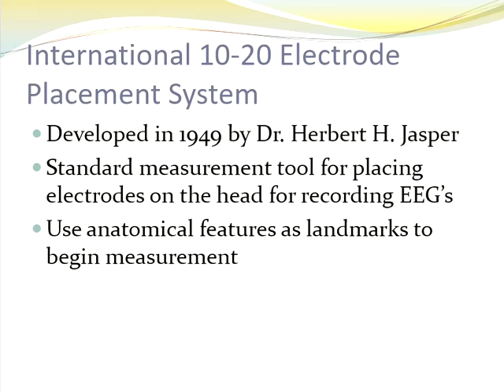We know that especially patients that have a history of epilepsy that need these types of studies done, it's tracking their progress, their disease progression, all of that, and they don't have to keep going to the same exact lab or same exact facility every single time. It's for standardization among the tests, so that we know what we're looking at, we know what area of the brain that we're recording it over.